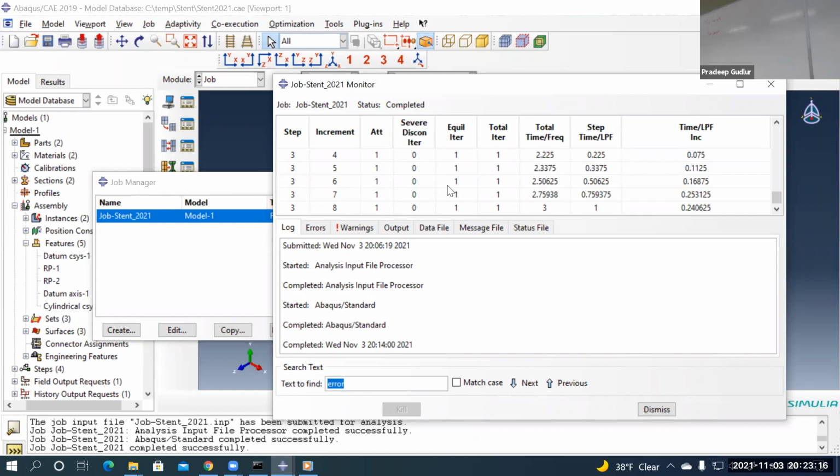Balloon, you will remove it. So I'll show you, I'll explain the problem. But then people have to see. So remove this, it is complete. Step 1 is expansion, both expanded. Step 2 is spring back. So only this contracts. If this has already plastically deformed so much, it stays put like that. It can't go back to the original shape.